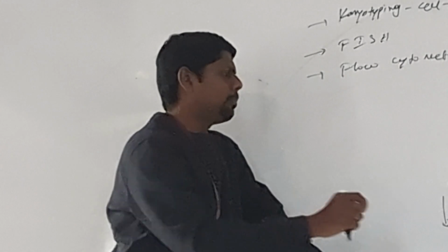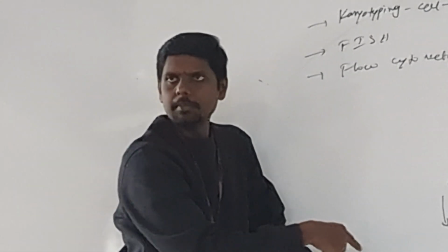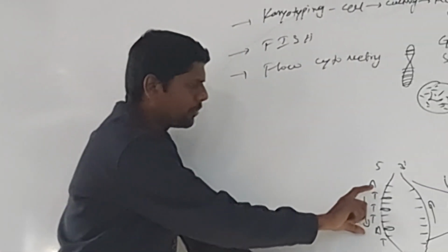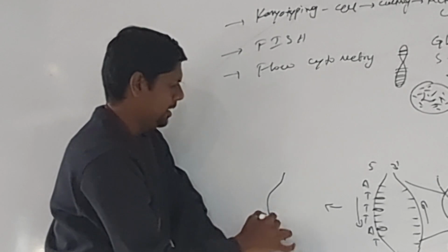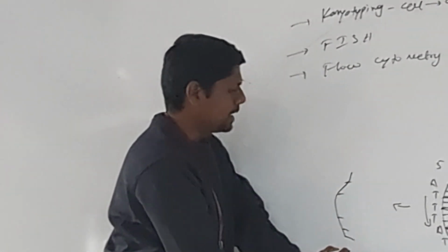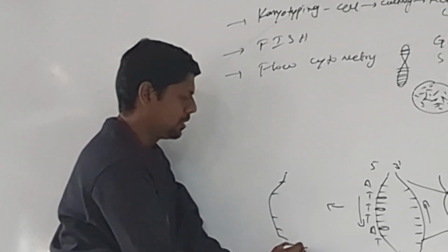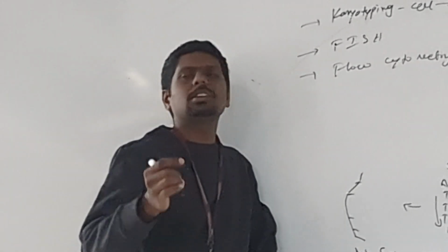Randomly they will purposefully remove some base pairs from the gene. Removal of these base pairs leads to a DNA strand with missing base pairs. This is called the introduction of nicks. I hope you know the meaning of nicks.